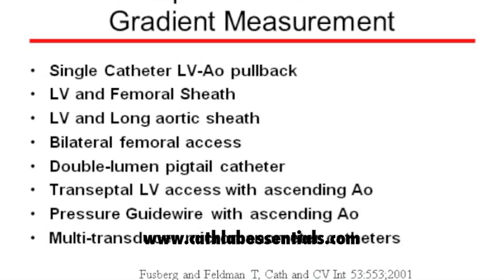In our laboratory now, we use a radial access with a double lumen pigtail and a brachial vein through percutaneous techniques. These are very effective, and we do not have the problem with femoral bleeding as we did in the past.